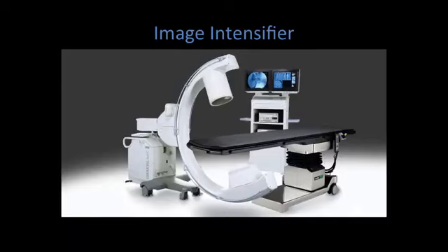Hey guys, this is a short video explaining the image intensifying system, which is composed of the image intensifier tube, but you also have the X-ray generator and the TV system, which is the rate limiting step in your resolution. The image intensifier tube has a resolution of 5 line pairs per millimeter, while the conversion to the TV system degrades that image to about 2 line pairs per millimeter.